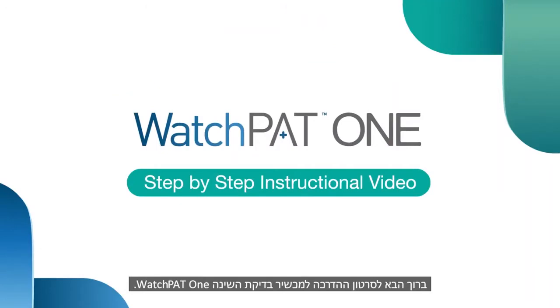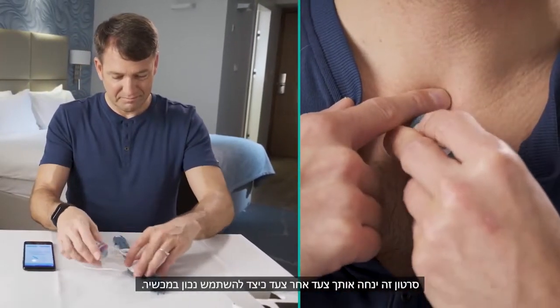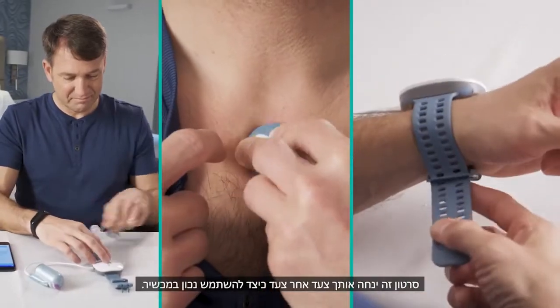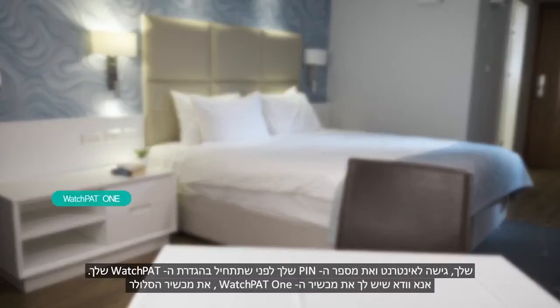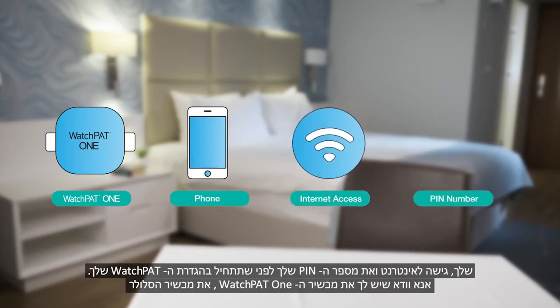Welcome to the WatchPat 1 instructional video. This video will guide you step-by-step through the correct use of the device. Please make sure you have your WatchPat 1, your phone, internet access, and a PIN number provided from your physician's office before you begin setting up your WatchPat.